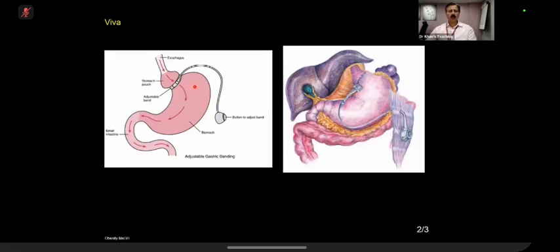So I'm not going to teach you anything other than this one complication, which is a potential exam complication. And please remember, you can also see it on a CT scan. I've seen quite a few patients now. Now, what happens in a gastric band procedure? First of all, the gastric band has various components, which can be seen on this diagram.